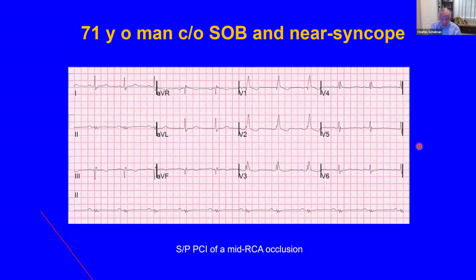And sure enough, a mid-right coronary artery occlusion was stented, and this is the ECG following that. See, the ST segment elevations are gone, and conduction has resumed. So there's now sinus rhythm with 1-to-1 conduction.